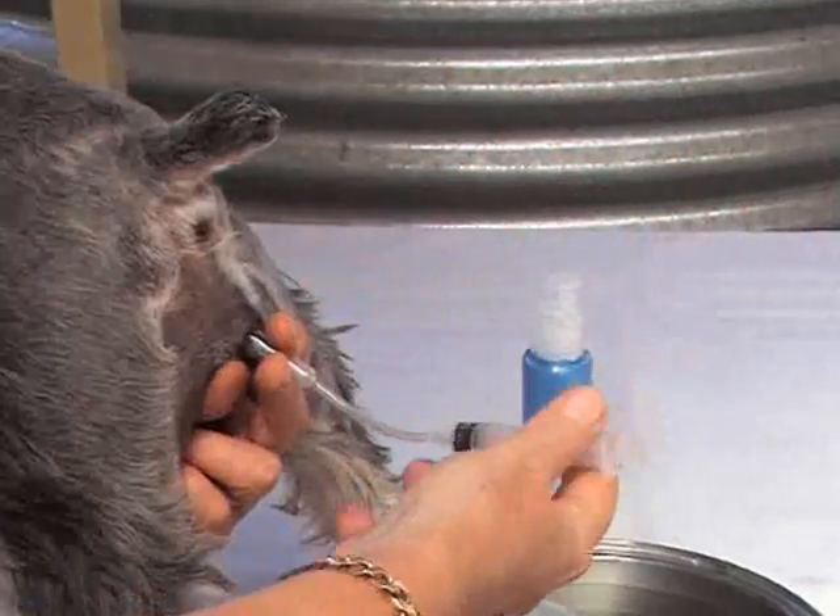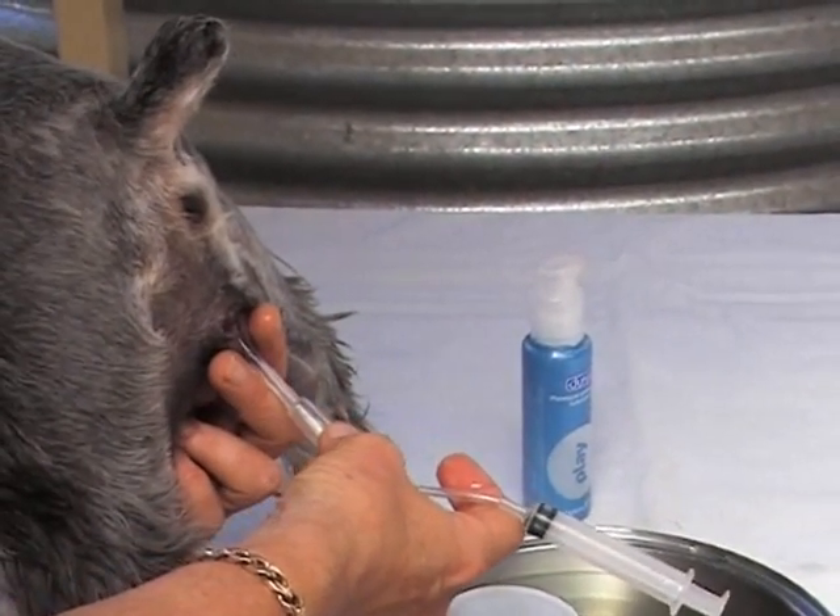That's all there is to it — she's done now. So you just pull it out like that. There's no reason why you, as a dog owner, can't just go ahead and make puppies happen for you.